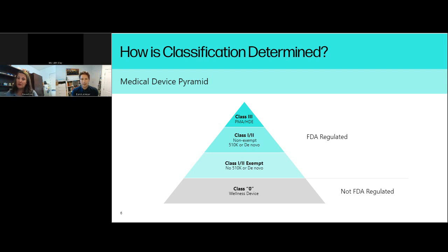The other part of this is that additive devices are really the only medical devices where there's a lot release criteria from a print standpoint. And that is a hot topic of conversation.